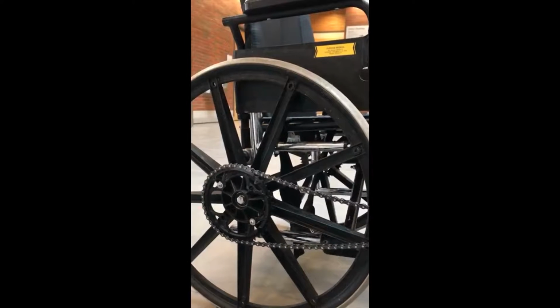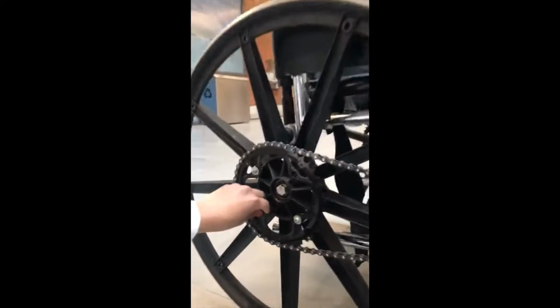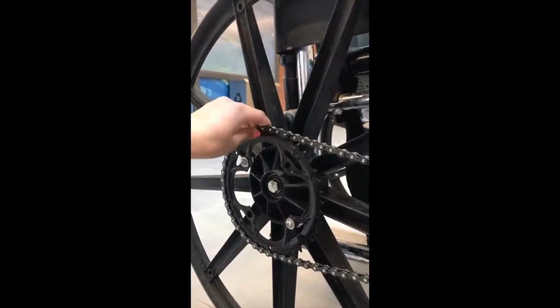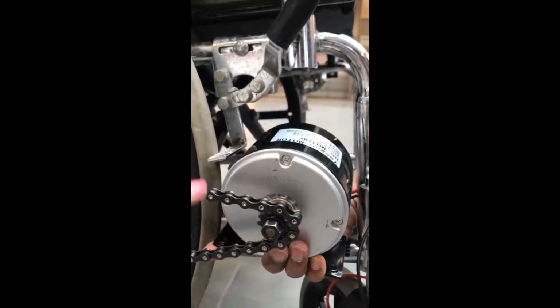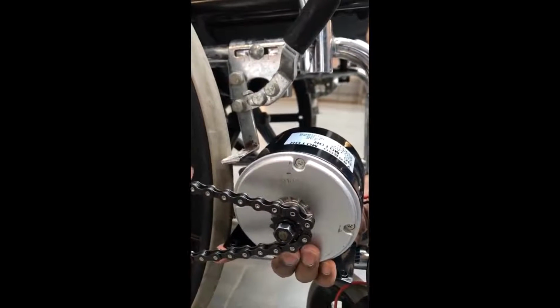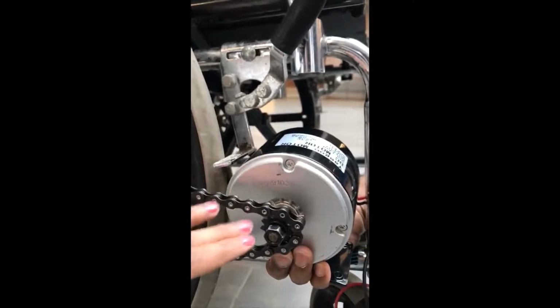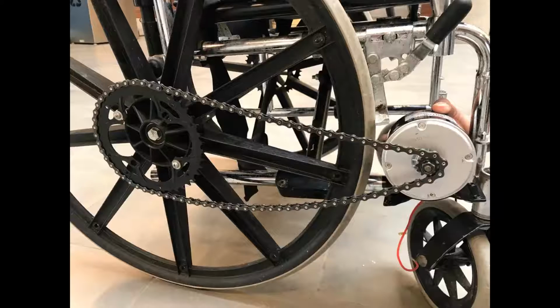So what we have here is our gear system, which is connected by a bike chain. We have a motor, and the motor is connected to a bike chain, which is connected to an outer ring of a bike, which is also connected to the big wheel of the chair, so it would be able to move the wheelchair. What would essentially happen is that the motor would move according to the Arduino commands through Bluetooth, and depending on if we say clockwise or counterclockwise, forward or backward, the motor would move, which would move the ring of the wheels that's connected to the chair.